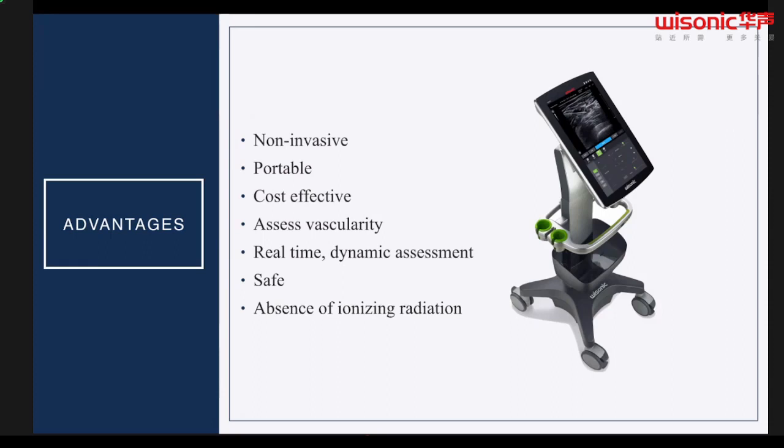There's an absence of ionizing radiation that CT scans have. And then there's really no specific contraindications to doing ultrasound. There's not a lot of those when they're maybe in pregnant patients, let's say, for CT scans. So there's a lot of advantages, obviously.